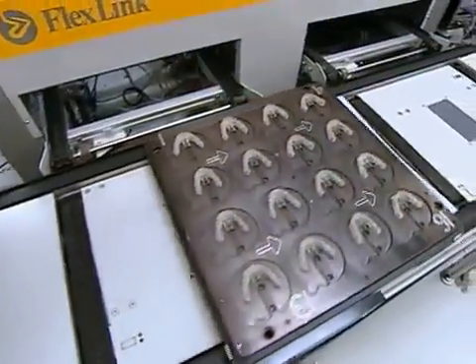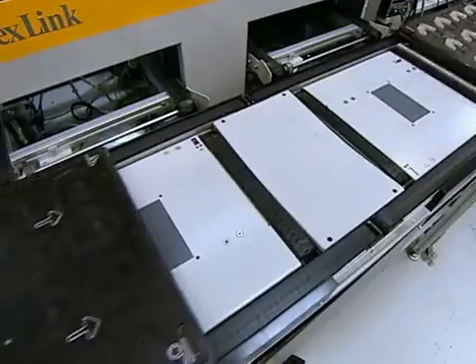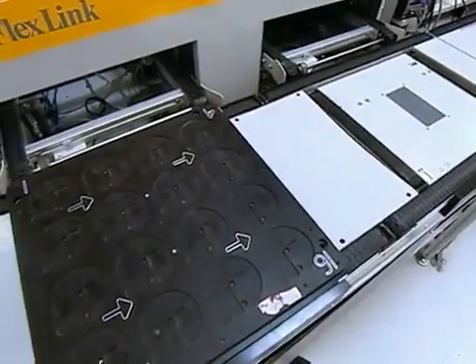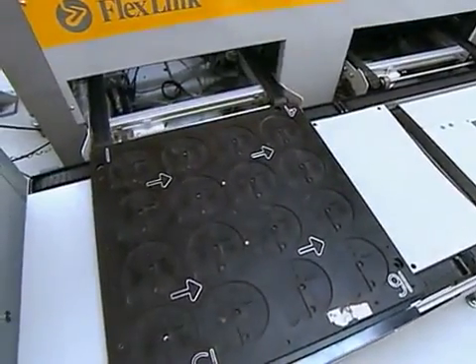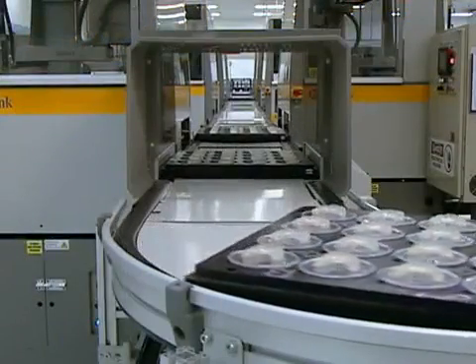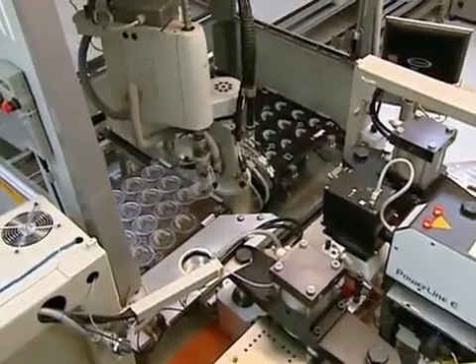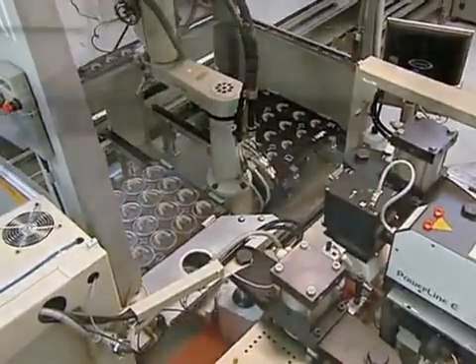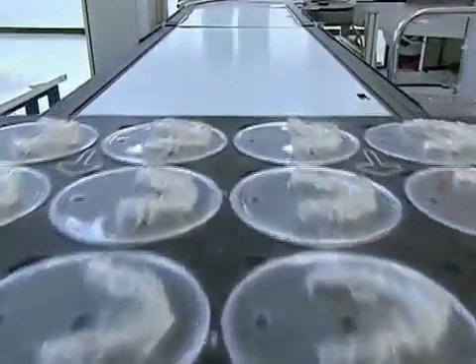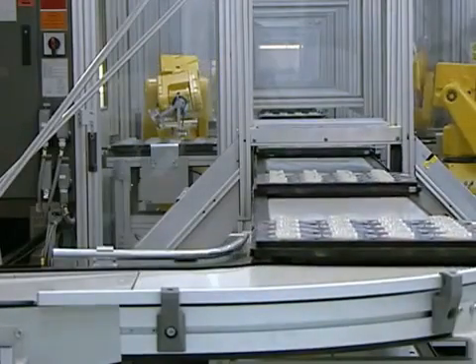The models will now go automatically down the conveyor system to various manufacturing processes. Another tray comes in, reloads, and the process continues. As it moves on the conveyor, it goes through a number of different steps, such as the forming and marking operations, where we actually thermoform the polymer over the aligner mold. The newly formed aligners are then released to the trimming function, which relies upon virtual data that you approved in your ClinCheck to trim the gingiva line.